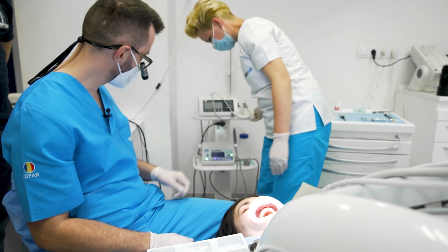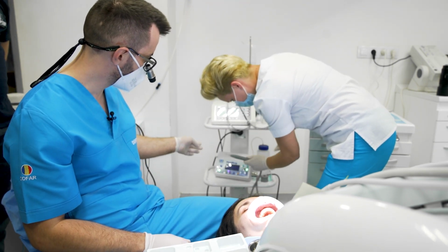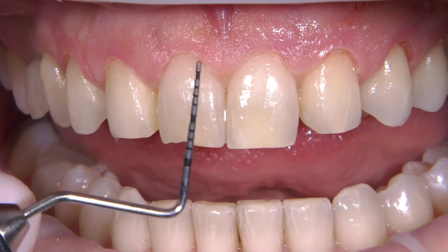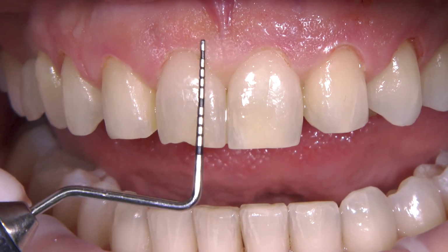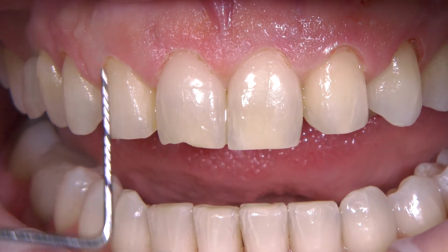Let's go to the next part. We will do the bone with an ultrasonic tip. This is the CV Dentus. After you cut the tissue, you need to reestablish the biological width. So imagine that the bone should be 3 millimeters away from the area that we recontour the tissue.